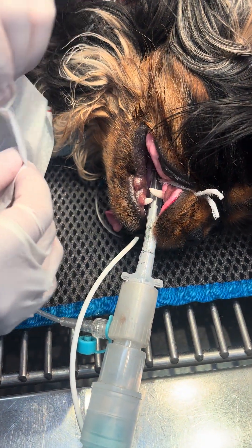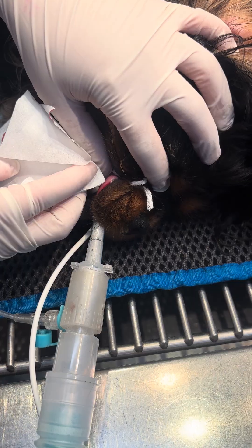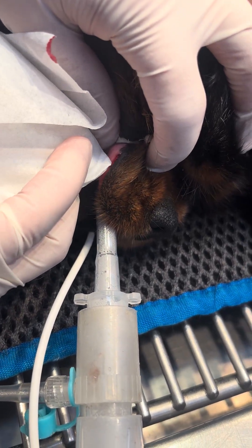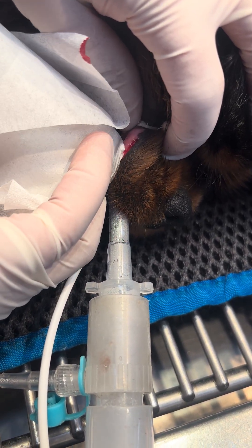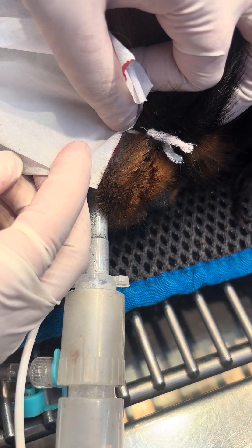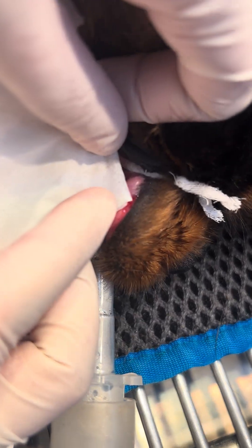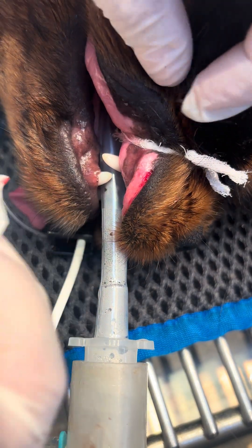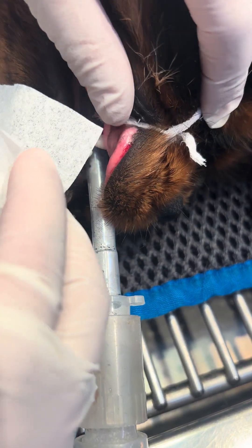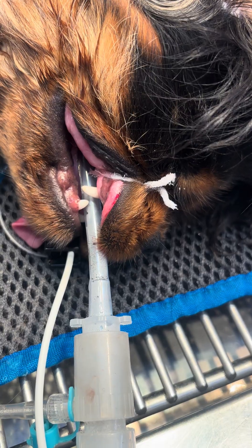It's already slowing down, isn't it? I'm going to roll the lip back so we can see it, because it may have already stopped.